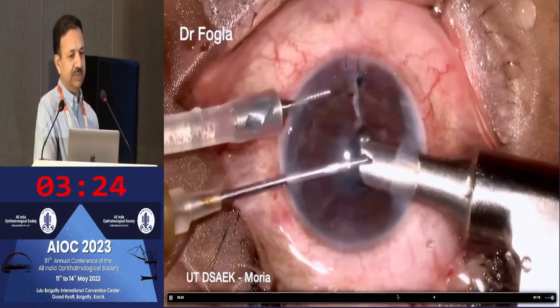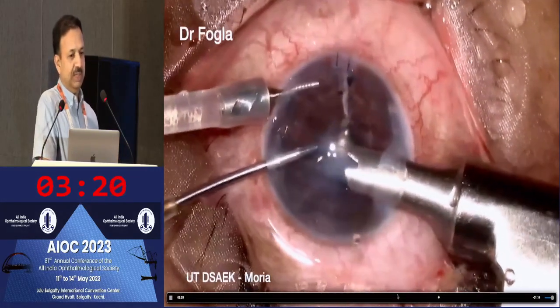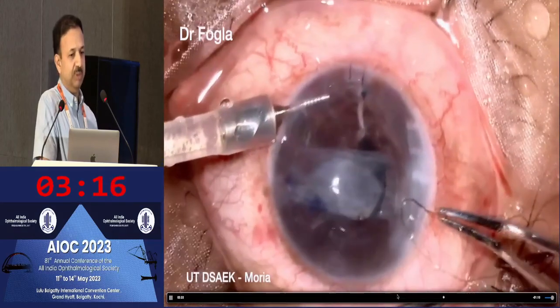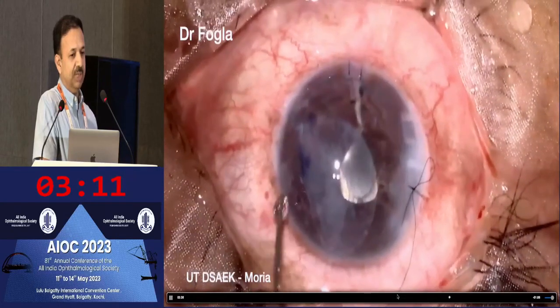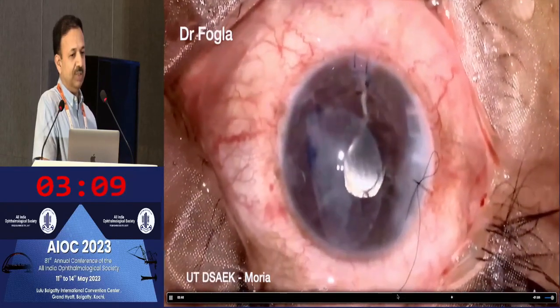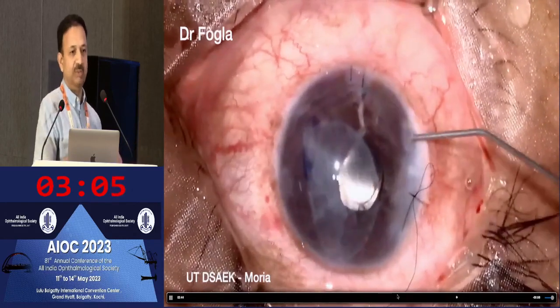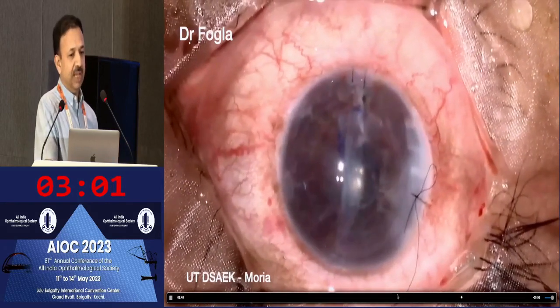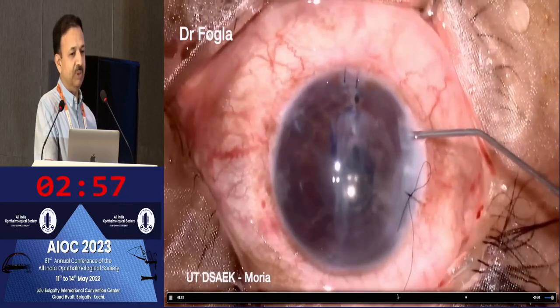We are using the Macaluso inserter, though you can even use a Busin glide. The AC maintainer keeps the chamber formed. Using micro forceps, we pull the graft into the eye. Once the graft is inside, we secure the wound. The graft does not snap open quickly like a regular DSAEK graft because it doesn't have too much stromal volume. You need to deepen the chamber and tap gently on the surface to make the graft open up.